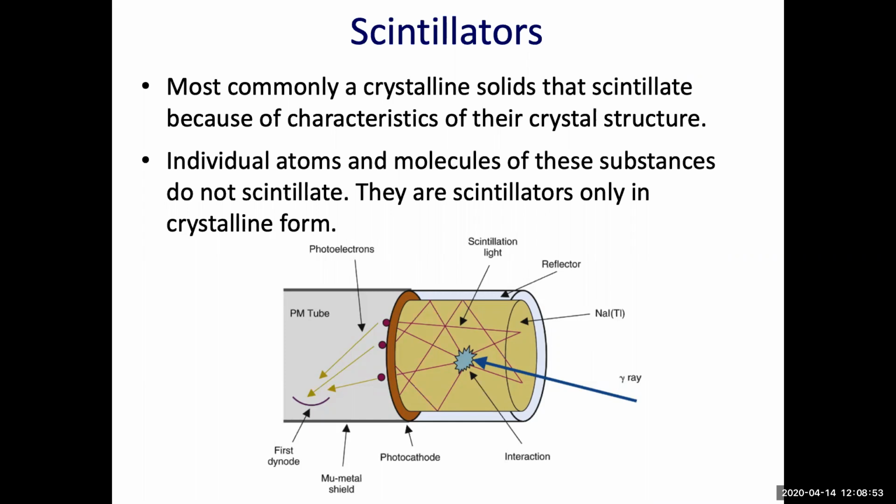Is this the same as X-ray scintillators? I'm not sure about this question, but the principle is that we use a crystal, for example, and the atoms of this crystal are excited by the incident radiation. So the electron will jump from one energy state to another.